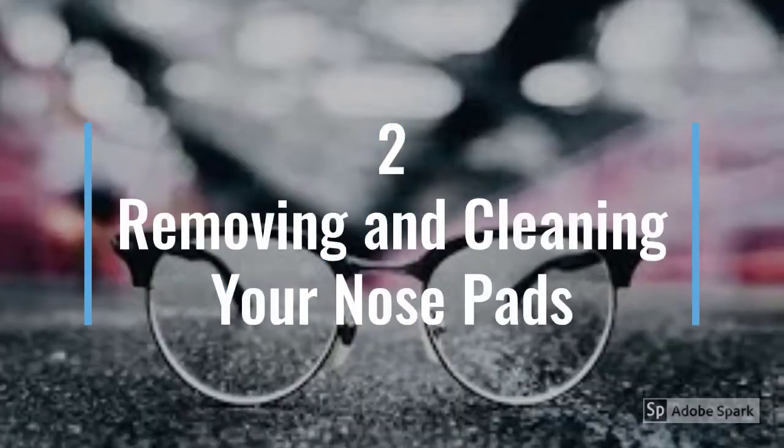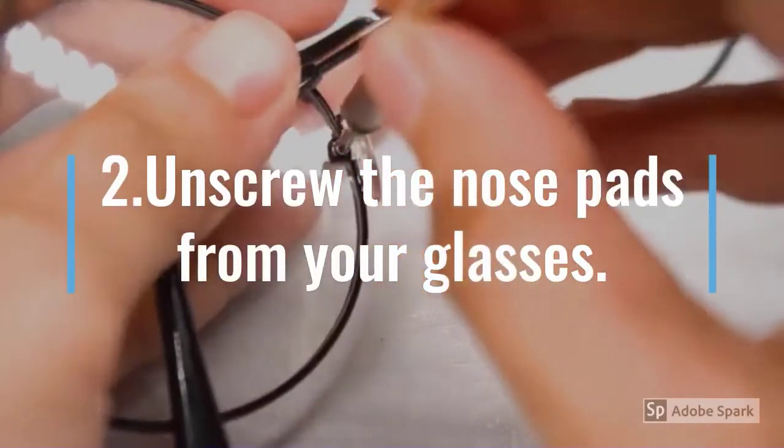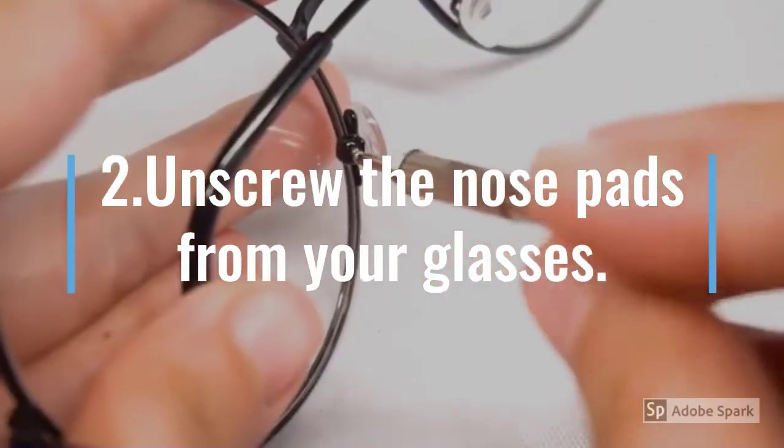Method 2: Removing and cleaning your nose pads. Wash and dry your hands, then unsecure the nose pads from your glasses.